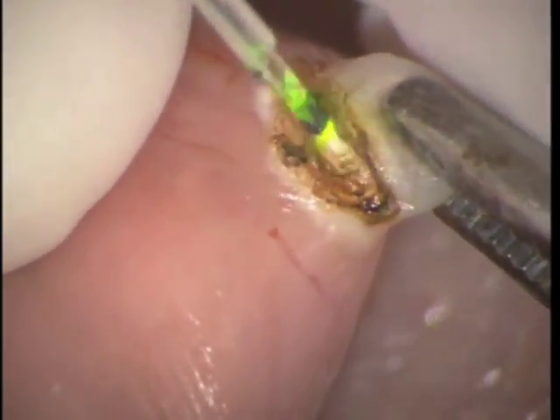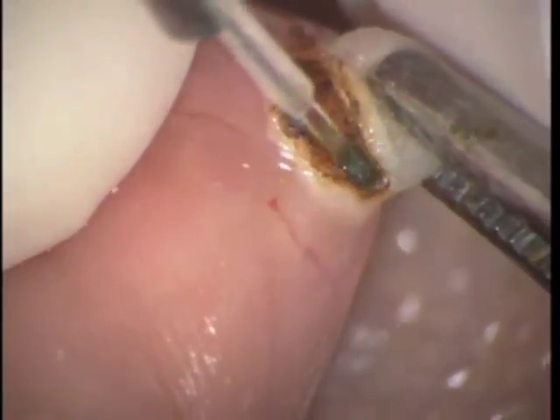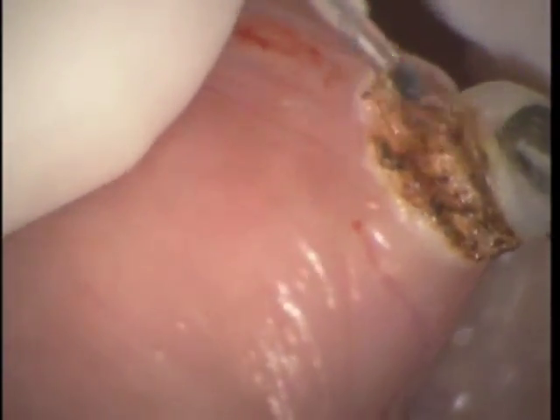You're using small brush-like strokes and evaluating the tissue-laser interaction to make sure you don't get a lot of charring. You can see here that the tip of the AMD Picasso laser is initiated on carbon paper to give a black hot tip.